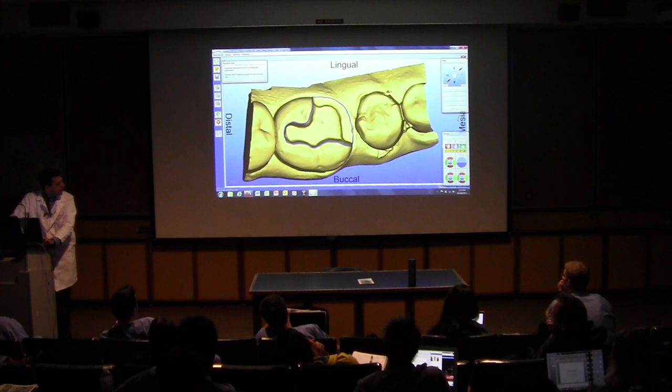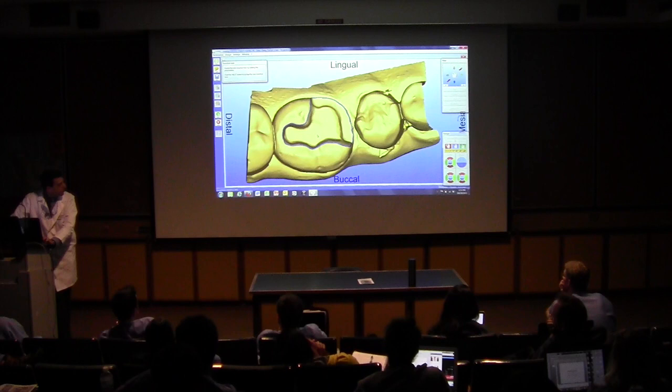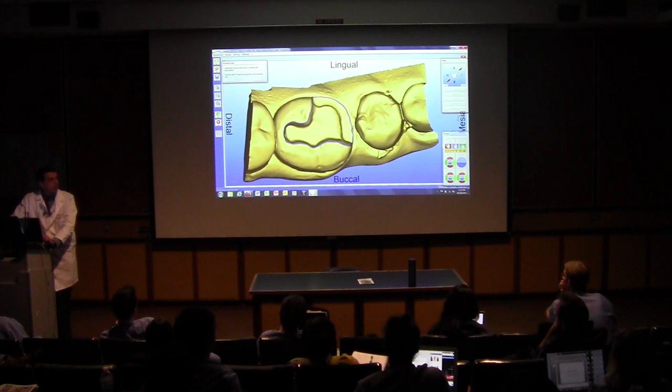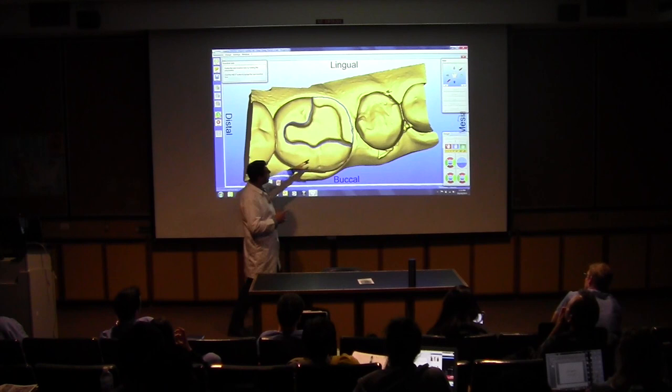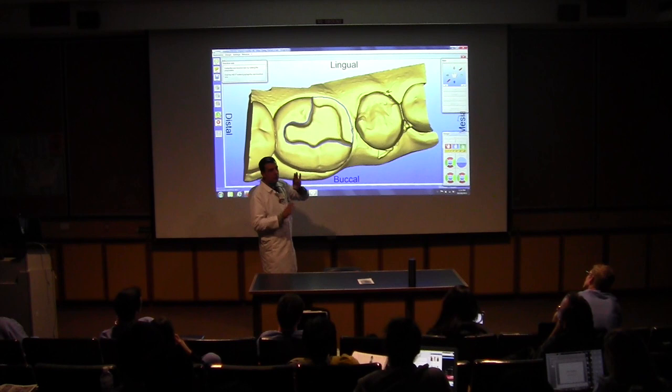At the same time, the software is asking to rotate this prep in a way that it can still see the proximal clearance. Do you have undercuts there? Can I see the clearance? Green light, you're good to go. Next step is, yep. If you see yellow, do you have to reprep? That's a good question. If you see yellow, even if rotated, and the yellow is still there, let's say right here between the axial wall and the gingival floor, absolutely. The software is saying there is something wrong in your prep.